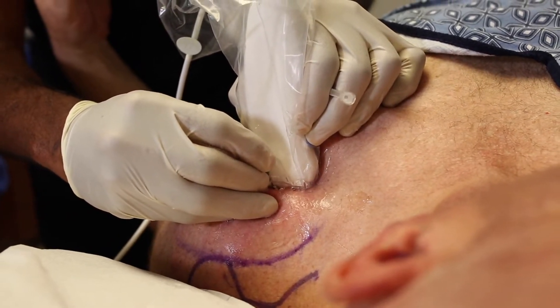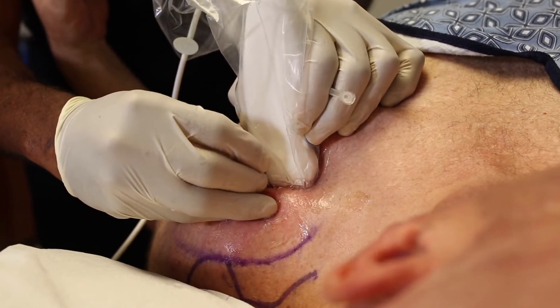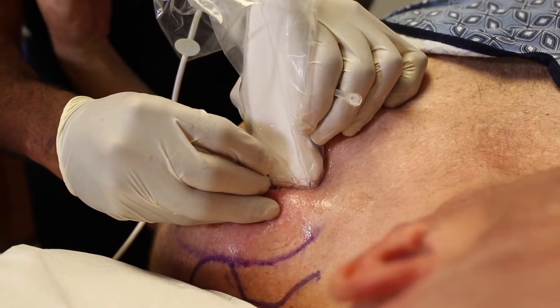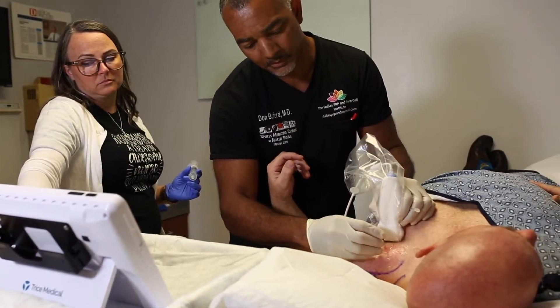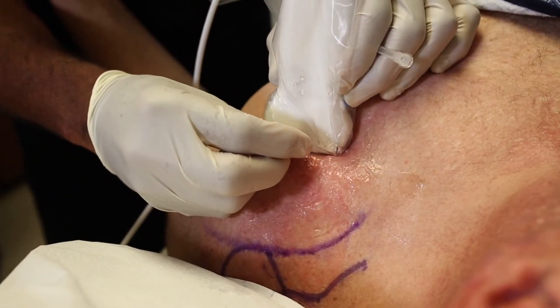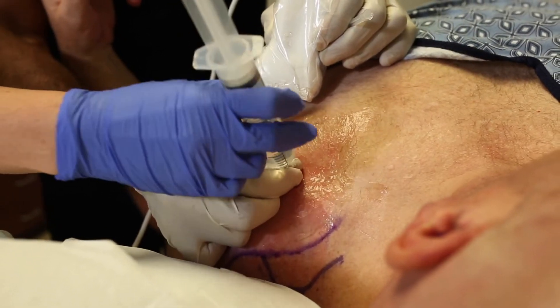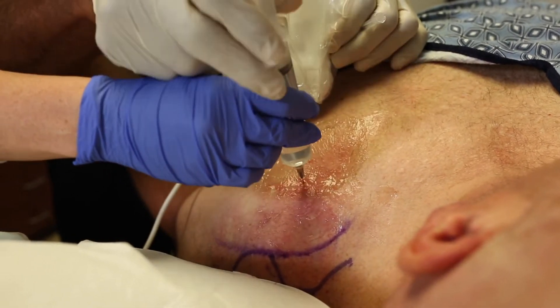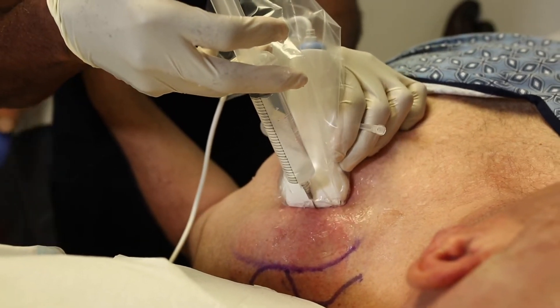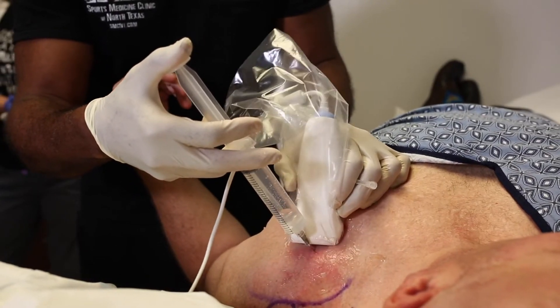This is a procedure that's very safe as long as you can visualize the anatomy, and obviously we don't do it if we can't see or palpate the coracoid. Here you can see our position in the clinic — we have a 22-gauge needle down to the coracoid and we know absolutely where we're at. We can now connect our anesthetic of choice. In this example it was lidocaine 1% with a little bit of epinephrine. We typically use anywhere from 10 to 15 cc's, and the goal is to place this just medial to the coracoid.